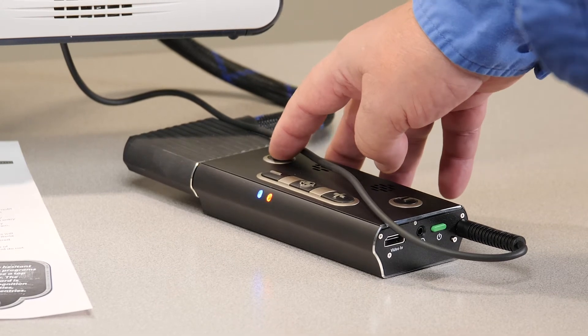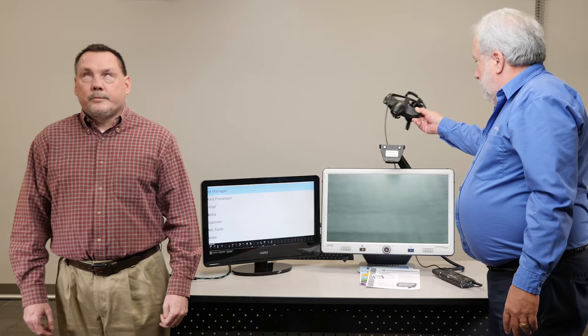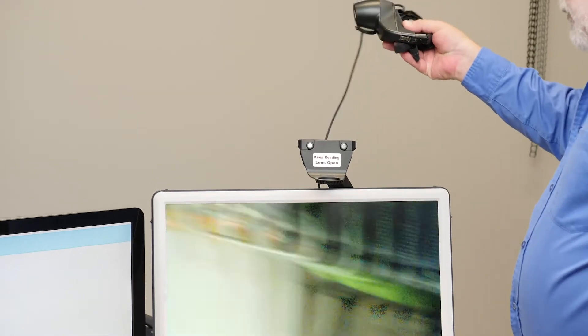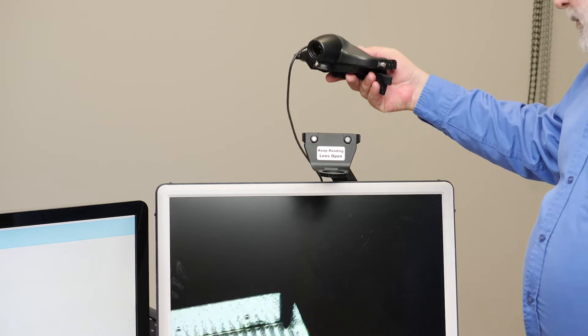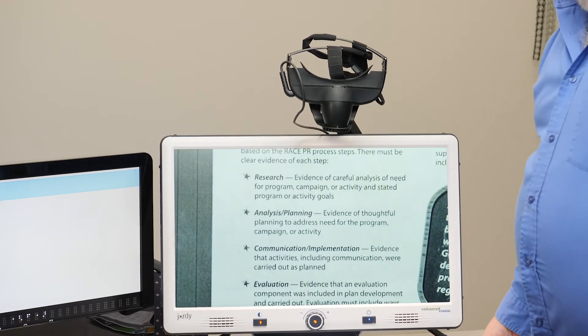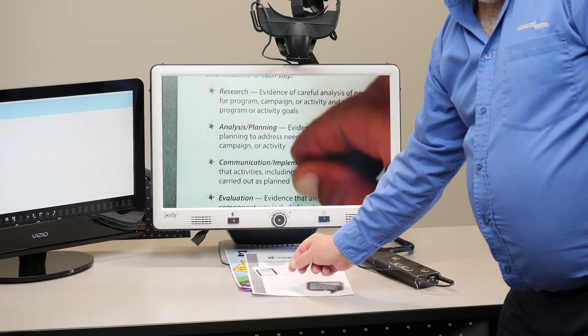The nice thing about this is when I do have it off like this, it can look in the distance as well. There's color so I can see across the room. But if it was on your head, you're much more stable. A student could see the blackboard, or the professor, or the teacher, and then take it off and put it onto this docking station and use it like this. I can put my hand underneath there and write with it.